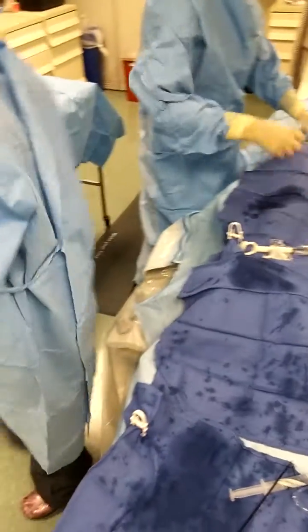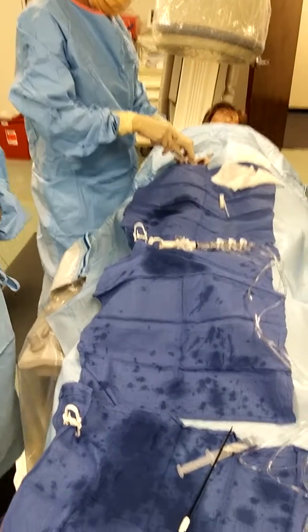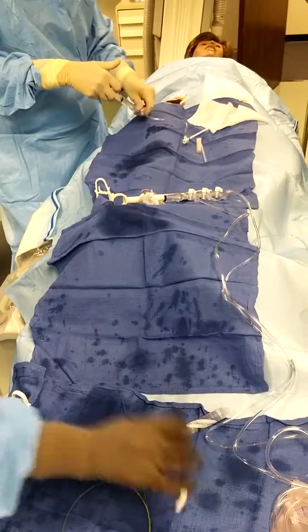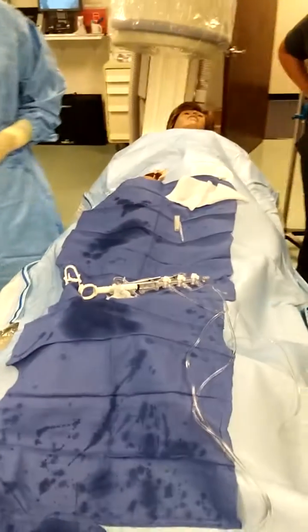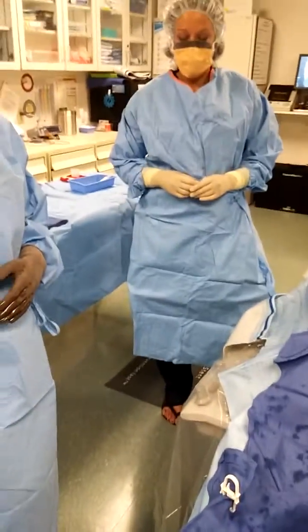Sharp's coming off the field. And circulator, I salvaged your needles on the floor. Okay. All right. I'm going to flush this back here and do it in the back here too. All right. That's it. Woo-hoo! Okay. All right.